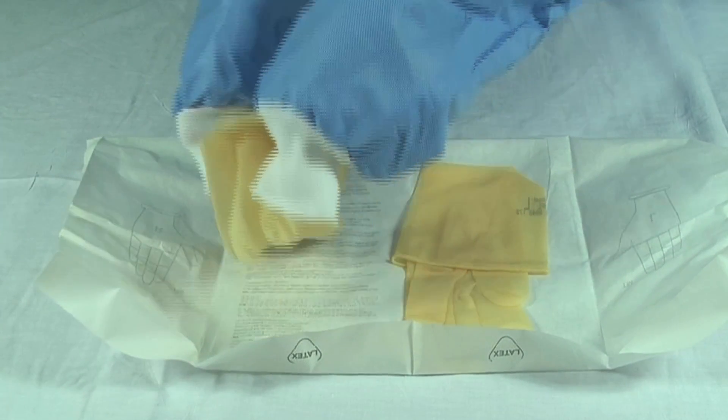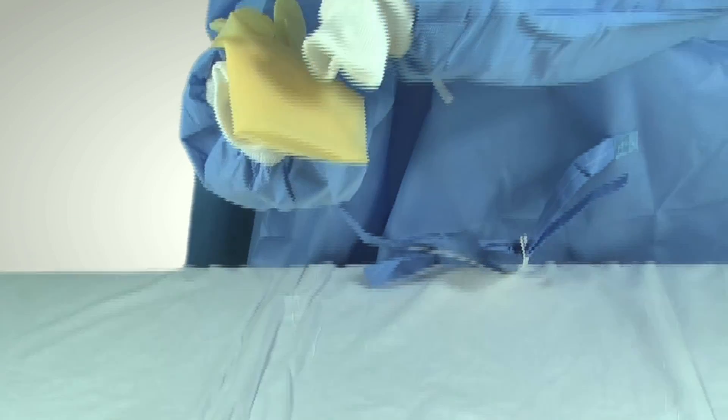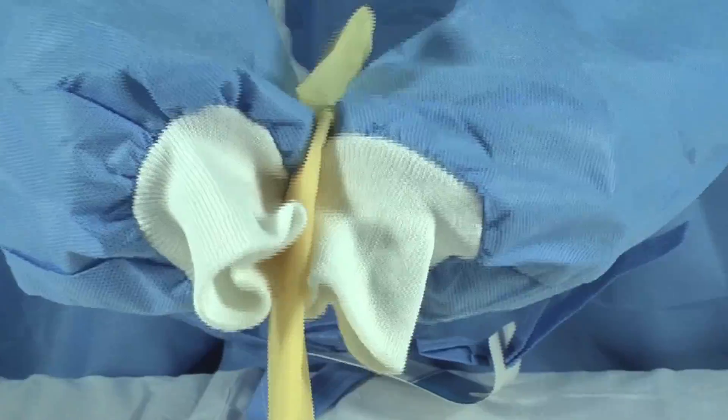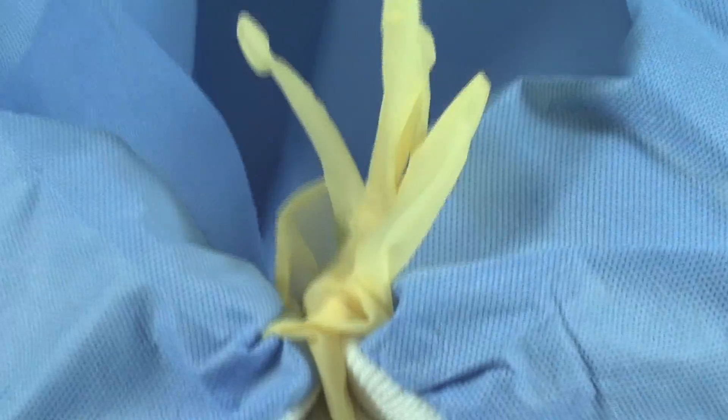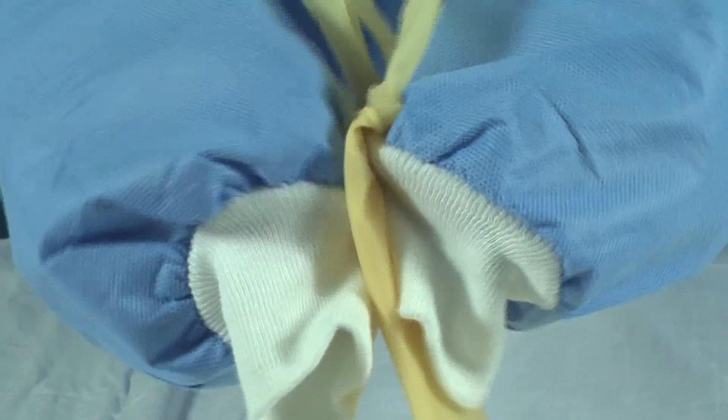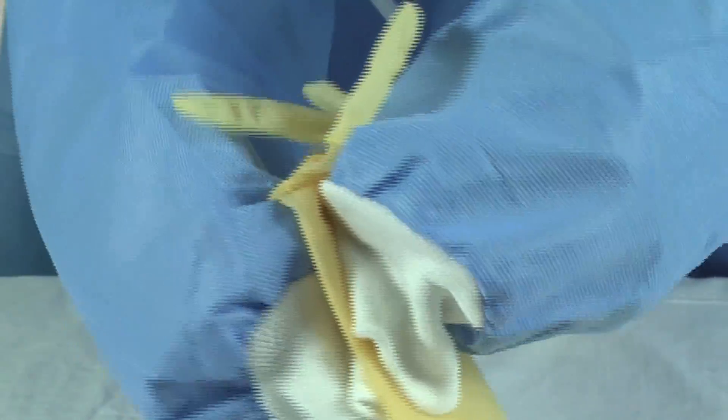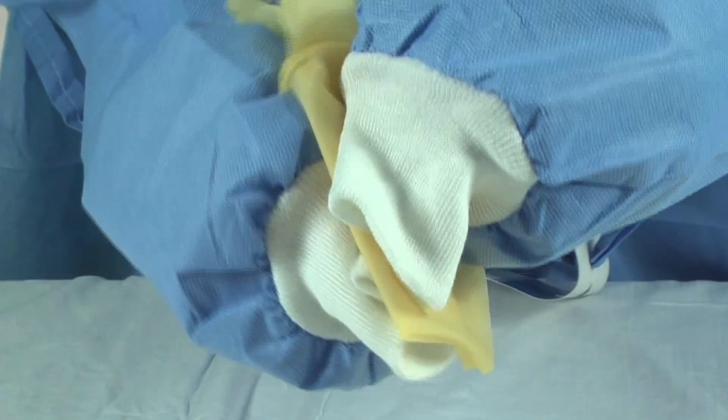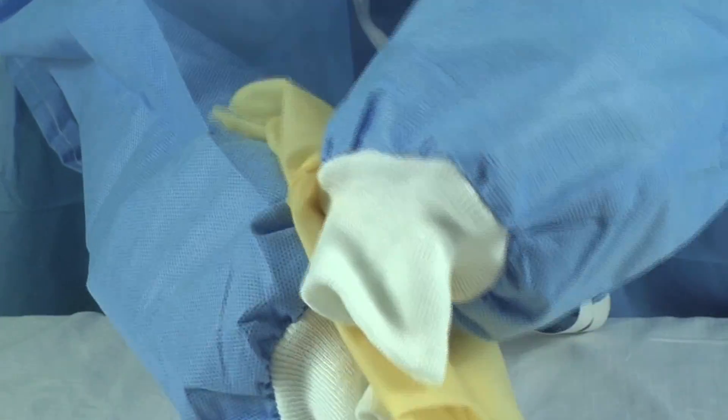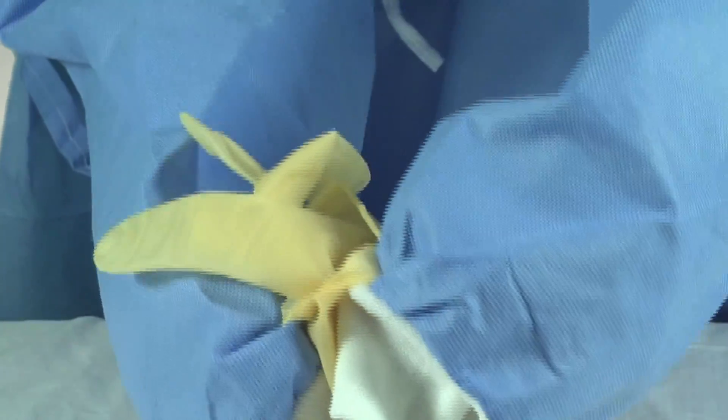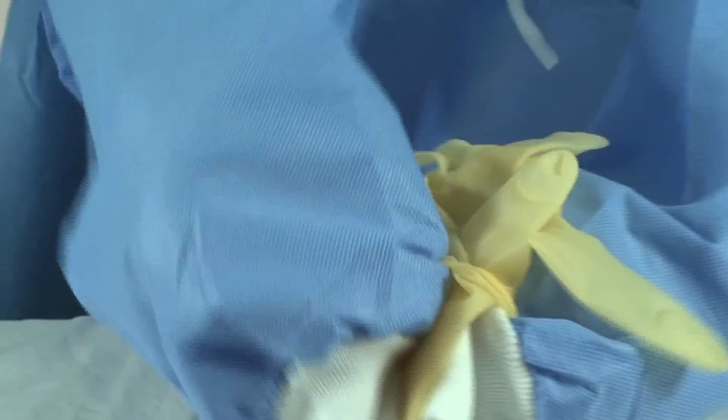Now watch how I do this. I pick this up and I lay this with the fingers going this way. Now, I'm very careful and you have to look really close. Notice how I just grabbed that corner there? See how I just grabbed that corner? I didn't grab that corner and the thumb, that'll really gum things up. I grab the corner there and I grab the corner here. And again, you have to look really close and think about this.